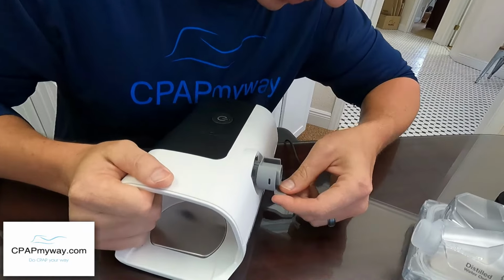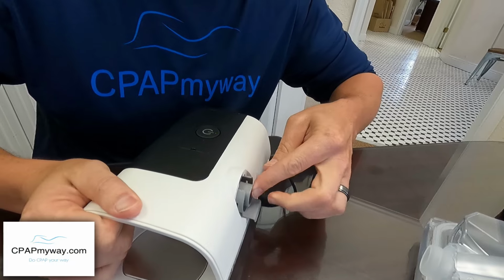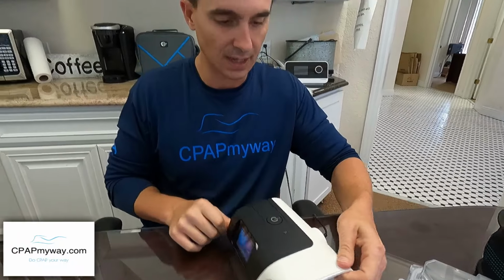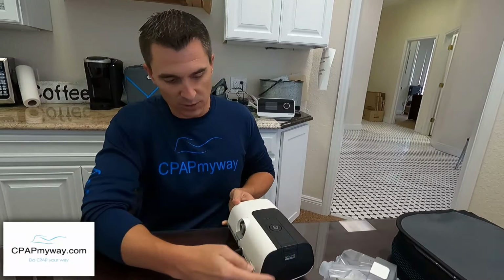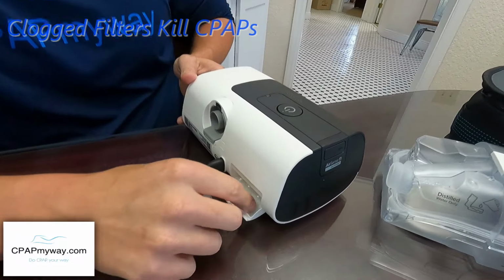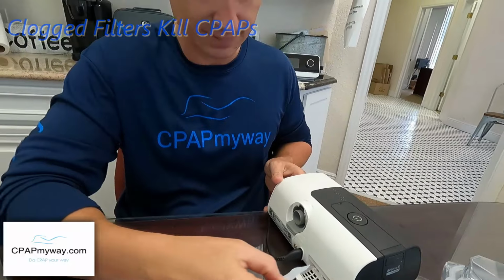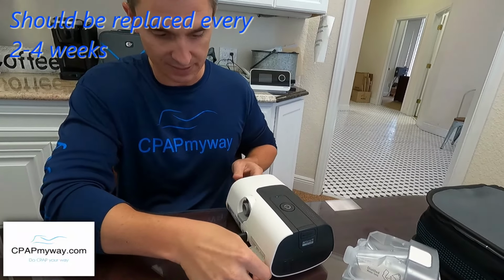And then once you're ready to put it back in, there's only one way to put it in. It doesn't rotate like the old model. Just push it until it clicks. That's once a week as well. And then once a week, you'll also check your filter here. So just pull it out, take a quick look. As long as it's not dirty or dusty, it's good to go. If it is, toss it and throw it away. That's the number one killer of CPAP machines, is not changing out that dadgum filter.